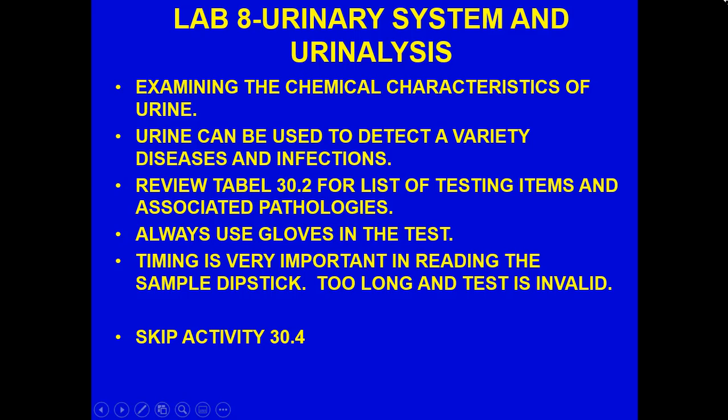They're going to also do the Dipstick Test. The Dipstick is a fantastic tool. And I know you're sitting there wondering, get a life. No, I'm serious. Think about this. In a matter of a couple of minutes, by dipping that stick in, you have a bunch of different chemical tests. Now you have to be, of course, wearing gloves, and you also have to be savvy about knowing how to read it compared to the indication colors on the bottle.